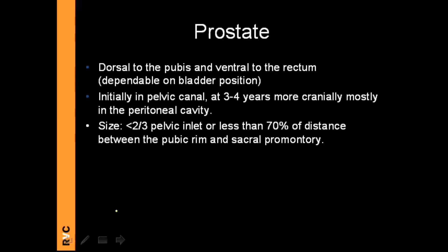The prostate is dorsal to the pubis, ventral to the rectum, and its position depends on the bladder. Initially it is within the pelvic canal, but from around 3–4 years of age it moves more cranially into the peritoneal cavity. A useful rule of thumb is that the prostate size should be less than two-thirds of the pelvic inlet, or less than 70% of the distance between the pubic brim and the sacral promontory. If it is more than that, it is enlarged.